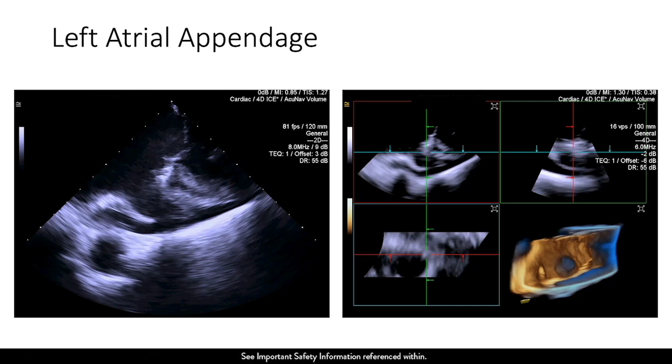The advantage of 3D is that rather than all the views that Devi taught us about, with the aortic valve and mitral valve in view and then putting it under the mitral valve, you can put it in one area and create what is called multiplanar reconstruction. So you can swipe it around, and it'll give you a 3D image, and you can see there's a nice 3D image on there, and we don't see any distal clot. So we were pretty happy. Of course, the patient is fully anticoagulated by now. We give heparin before transeptal puncture.